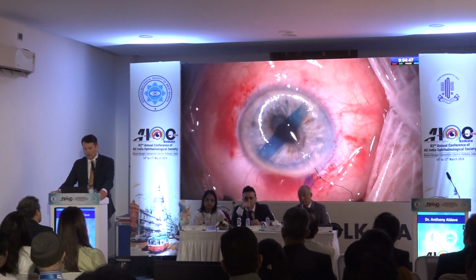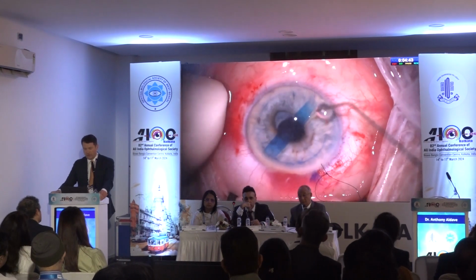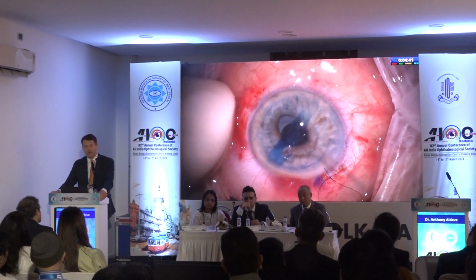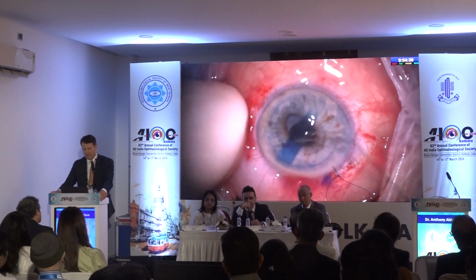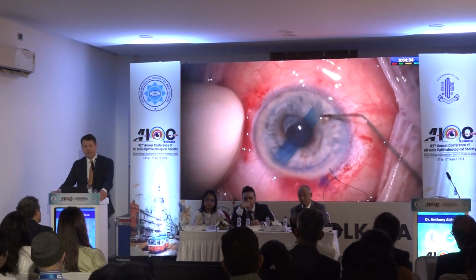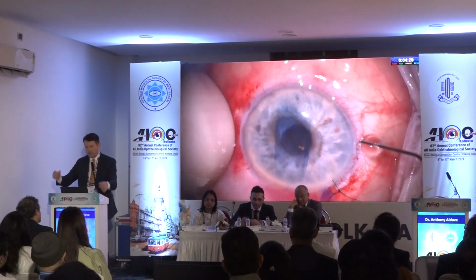I'm actually able to get this cornea in more of a flatter configuration that's going to allow me to begin to unfold this graft. A finger on the globe can also be very helpful to bring that iris plane up on these eyes that have very deep anterior chambers. And when you release that finger, the cornea will become concave again. It will sort of lock in a graft you've been able to unfold.